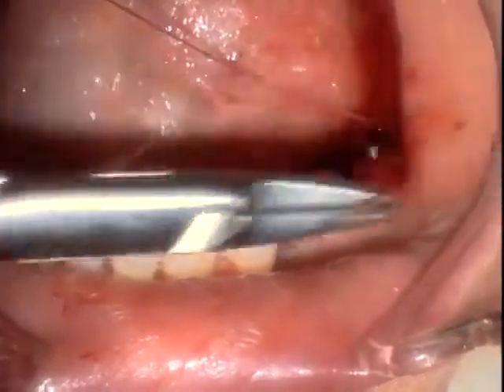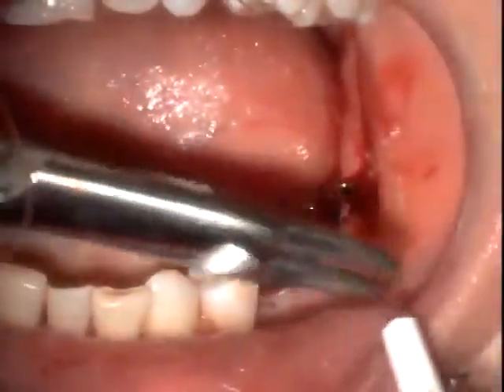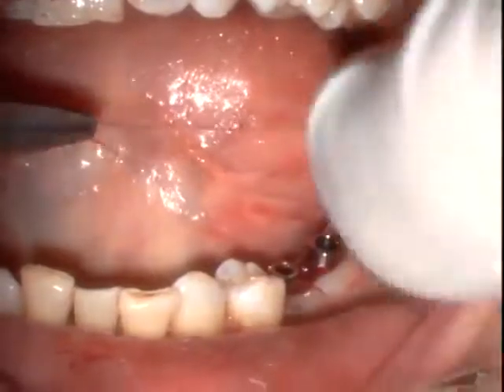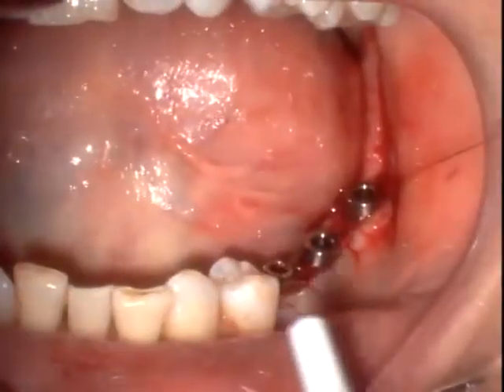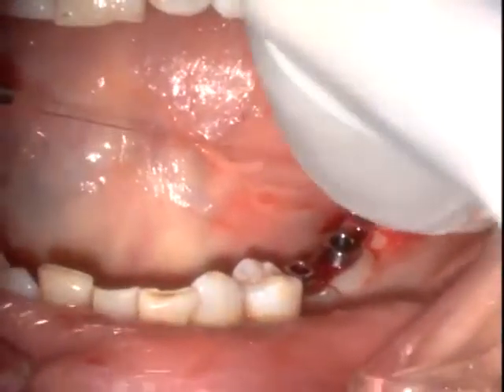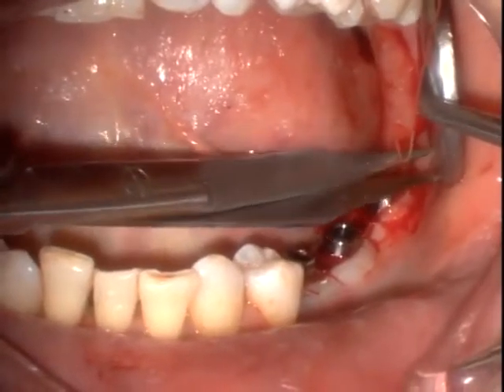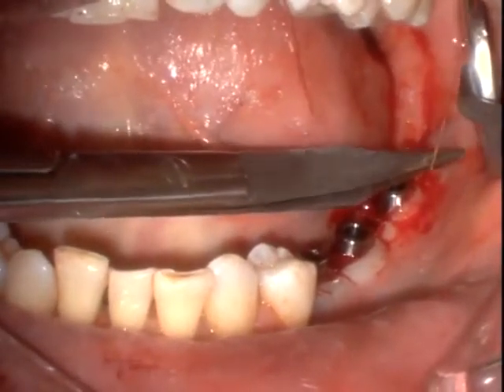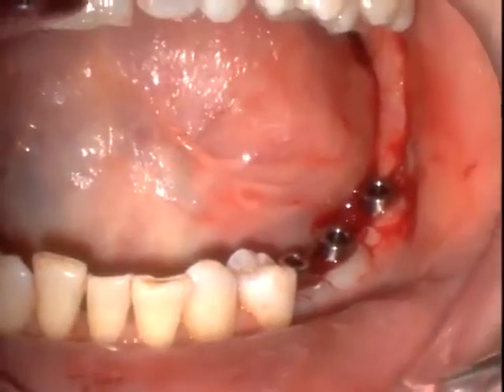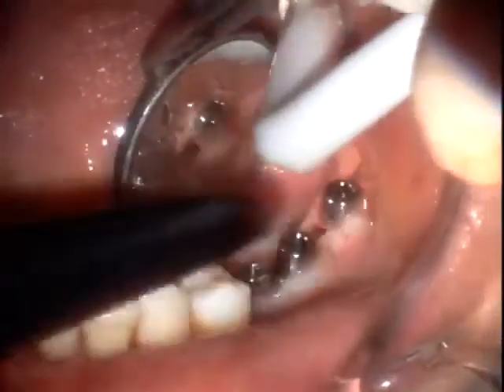One of the biggest dilemmas I see clinically is when people place implants in the posterior mandible without taking care to make certain that they have keratinized gingiva on the facial aspect of their future restorations. This is an area that's usually limited in terms of the amounts of keratinized tissue, and this becomes even more of an issue when these teeth are lost due to extraction.